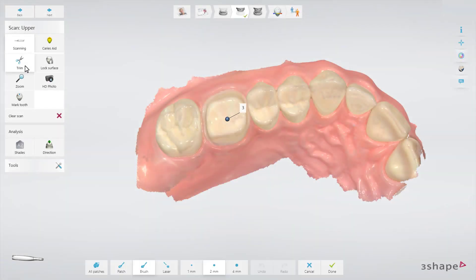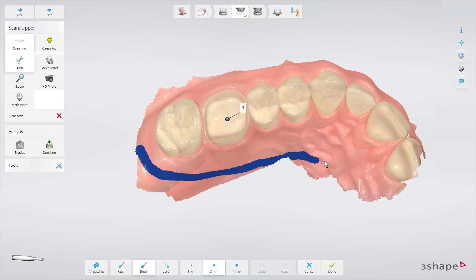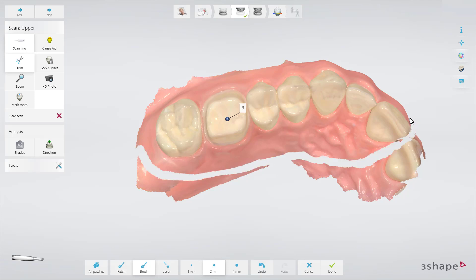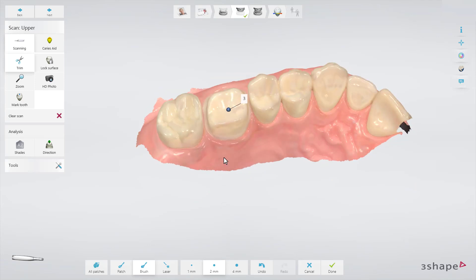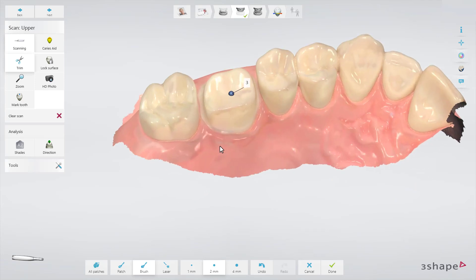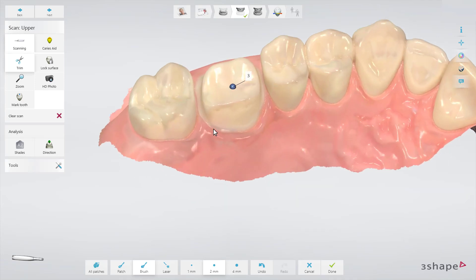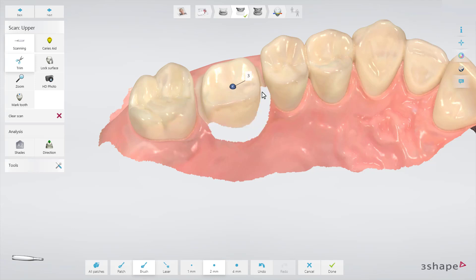Trim is used to remove areas that you don't wish to have in your scan. We recommend trimming larger soft tissue areas, tongue and fingers completely away. You can also use Trim to edit your preparation — in case you wish to change a bit on the margin or height of prep, just trim it away.